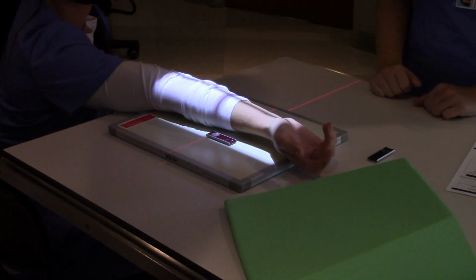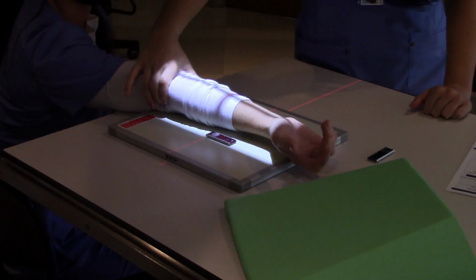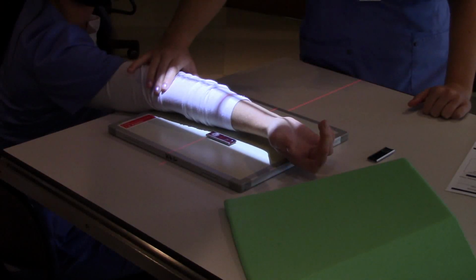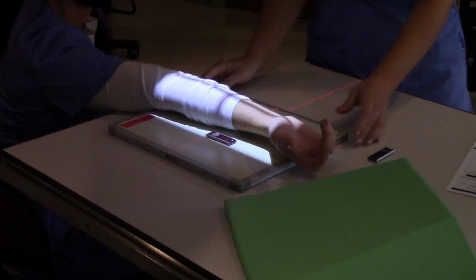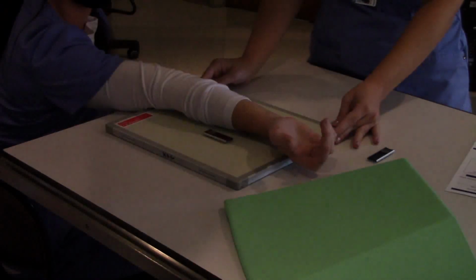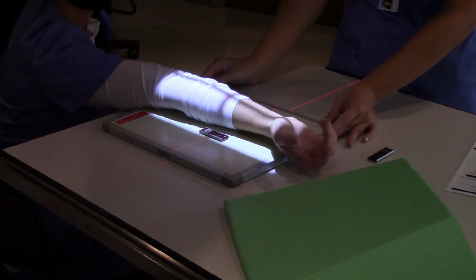Okay, now squeeze on her epicondyles and make sure that they're going to. Okay, so do you think her elbow joint's going to be included on this image? Maybe. Okay. Should I put more of that? I'm thinking. There you go. Push it down like that, because I think you've got plenty of wrist anatomy on there.